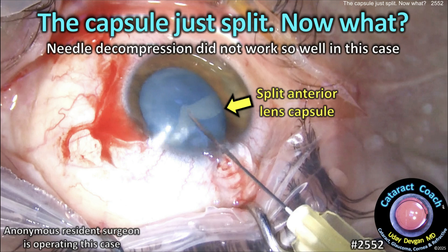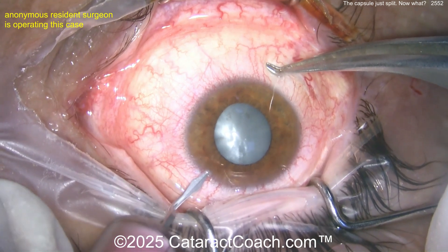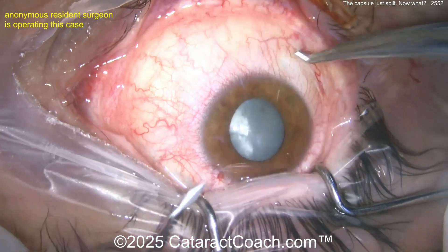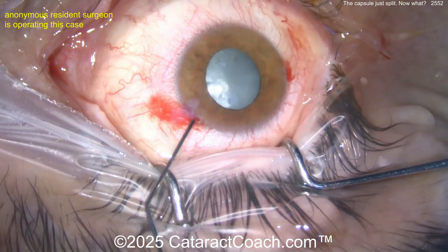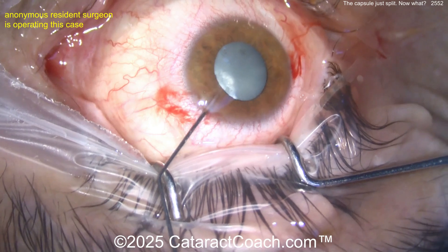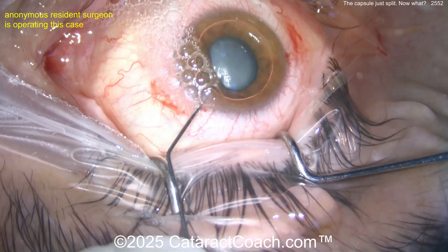From cataractcoach.com — the capsule just split wide open, now what do you want to do? Needle decompression did not work. In this case of an intumescent white cataract, let's watch this anonymous resident who's operating. Starting off with a paracentesis — the surgeon sitting superiorly, patient is a little all over the place. Maybe you want a good peribulbar or retrobulbar block here. Now looks like putting in an air bubble — okay, that's reasonable.